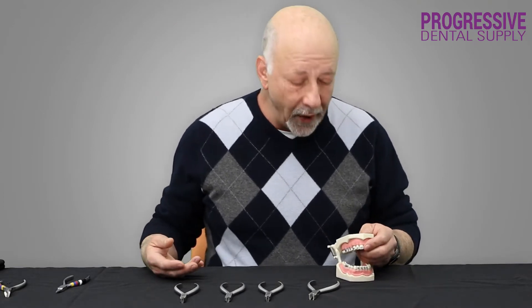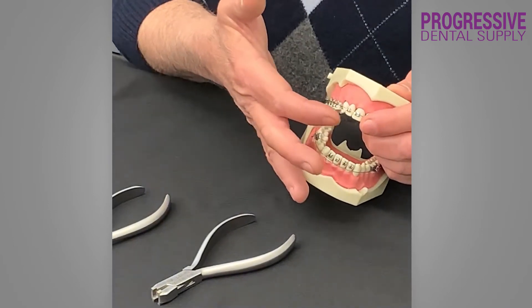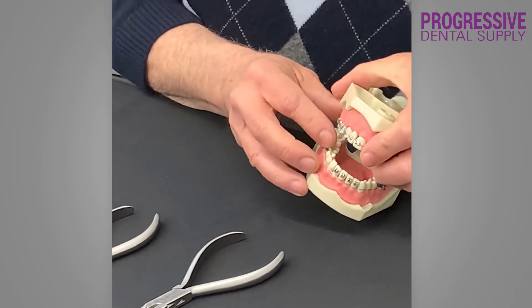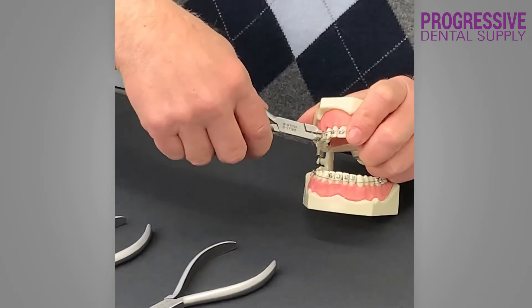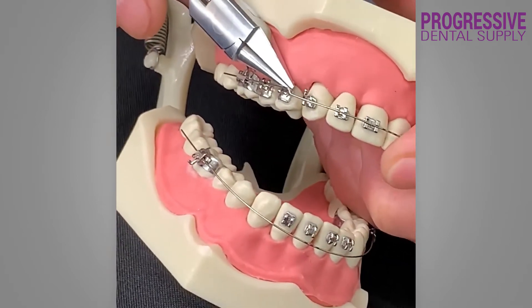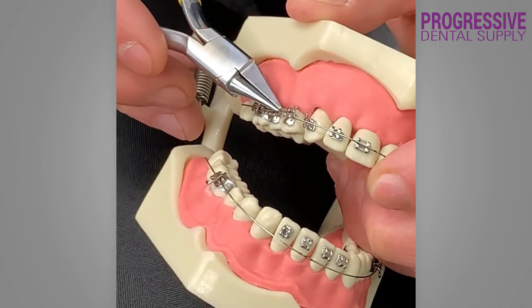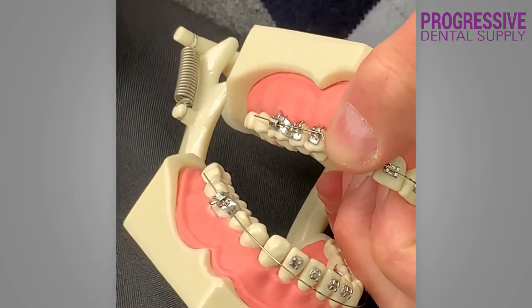I want to show you how we use these pliers intraorally. What I recommend is for you to untie a couple of brackets in front of and behind the tooth that you're planning to bend. Then push the wire away from the tooth a little bit so you don't damage your bracket bonding. Then just place your plier right in front of the bracket or the tooth where you're planning to make the bend, and just go ahead and give the plier a full squeeze. You can see right here the step, then the angulation. This will move the root distal, the marginal ridge of the mesial will move up, and this will leave the marginal ridge on the distal even.